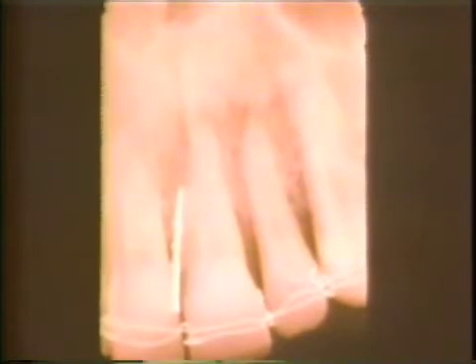The Hirschfeld silver point demonstrates that the pocket is truly an infrabony defect. The calibrated point is flush with the gingival margin on the mesial surface of the tooth. It shows that there is a 12-millimeter defect from the gingival margin to the base of the pocket, six millimeters of which are actually infrabony in character.